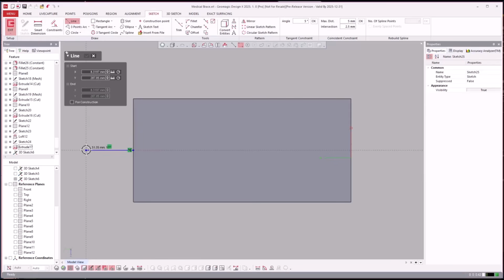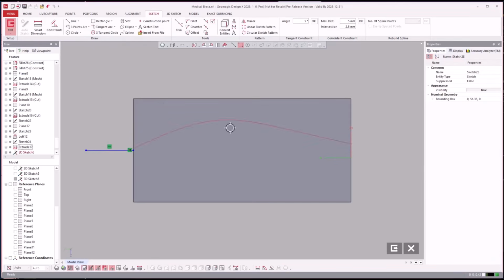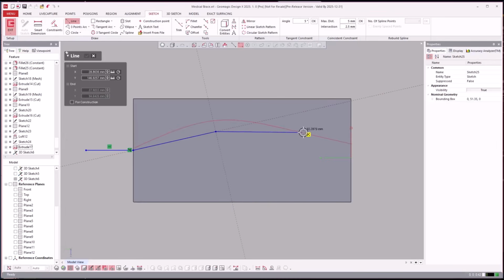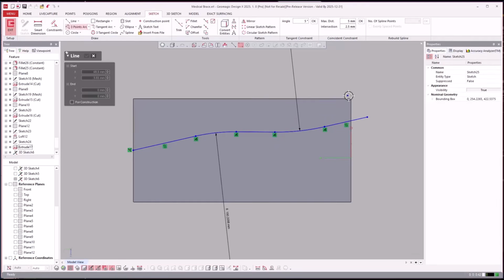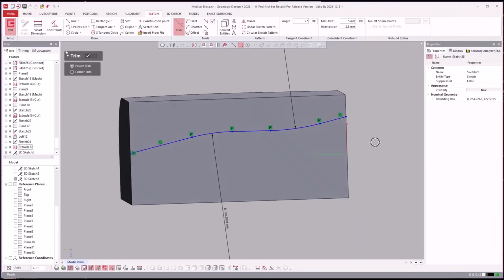So let's just combine what we've learned today. Kind of didn't want to do that, but whatever. All right, so I'm just thinking here. Yeah, let's do this. And I don't need this. I'll just trim this off. I could convert entities. There's lots of different ways you could go about doing this, but let's try it this way here. Just thinking out loud here.